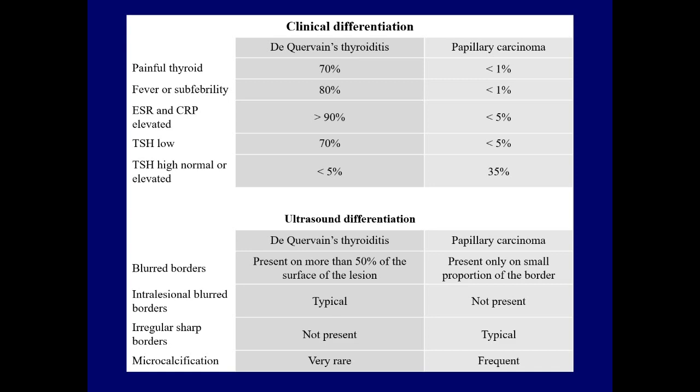On the other hand, the sonographic presentation of de Quervain's thyroiditis is very close to that of papillary cancer. There are only subtle differences. The most important signs are the cloudy appearance of thyroiditis, caused by the ill-defined borders between intralesional structures, and the presence of microcalcification in the event of papillary carcinoma.